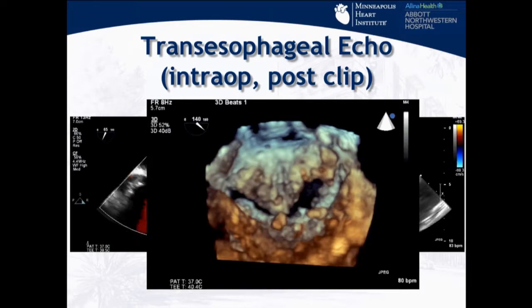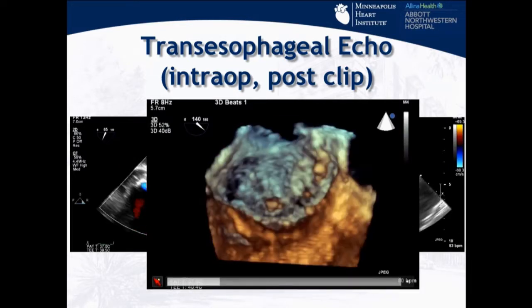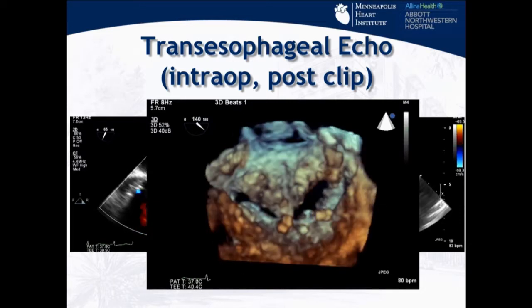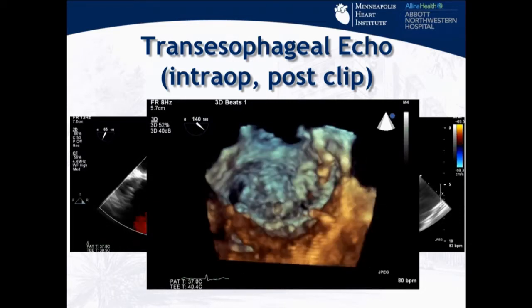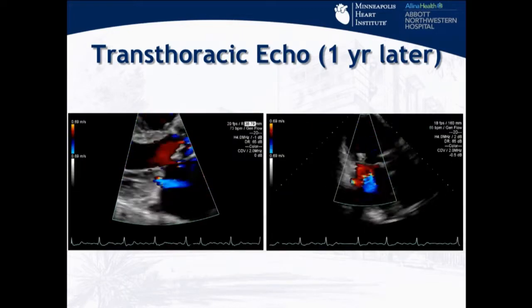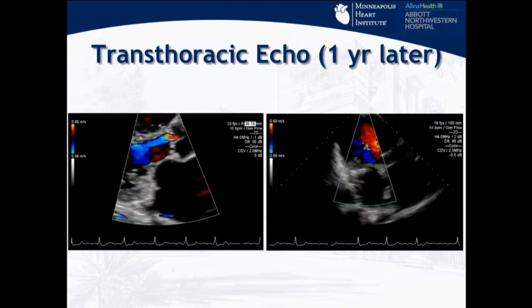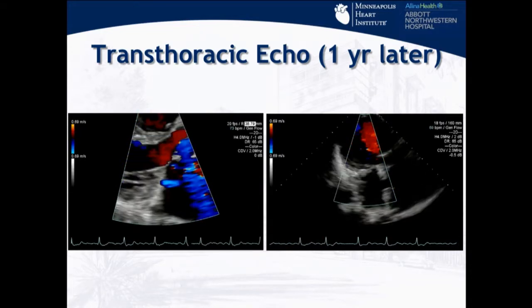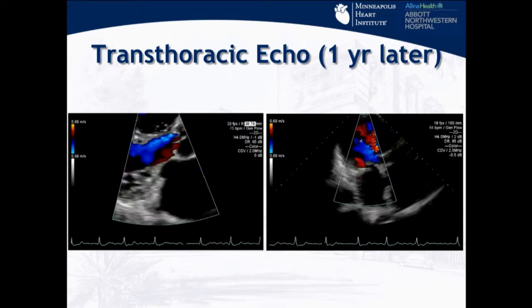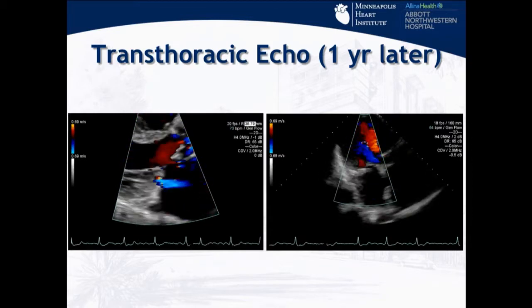So here's 3D. I've seen some surgeons thought they'd take some of these in when they reoperate and just grab them and pull them apart in surgery. You can't. You have to stick a little thing in the middle and unscrew it. So the result was great, and then I thought, okay, now I'm going to prove what Paul is doing here, and found a 1 year later echo here, and it's still great. I think it's still maybe what we call it now, mild mitral valve regurgitation. Manny would call it 0.